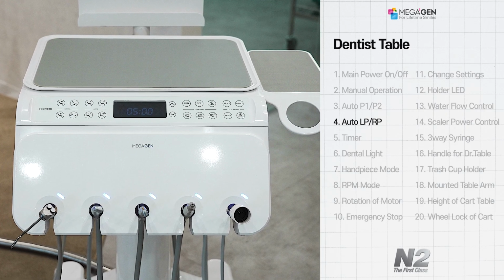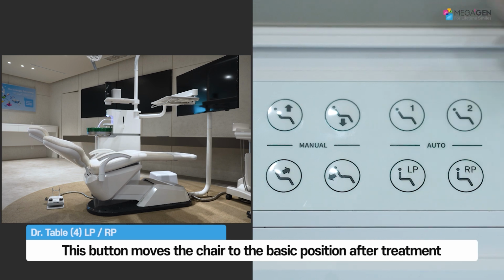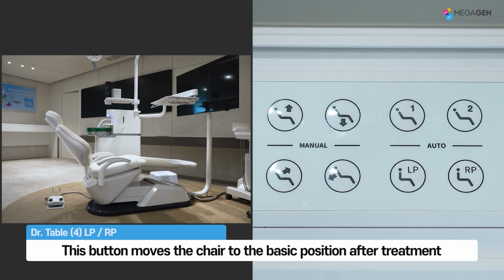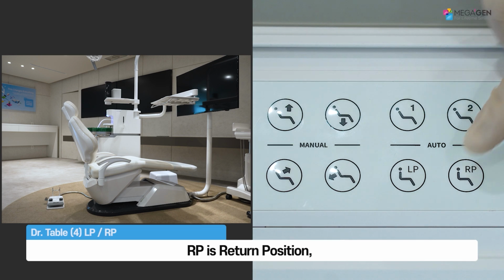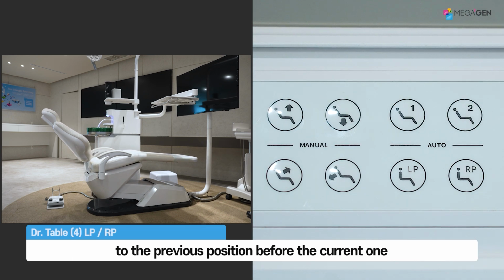Next is the LP-RP function. LP is last position. This button moves the chair to the basic position after treatment. RP is return position. This button moves the chair back to the previous position before the current one.